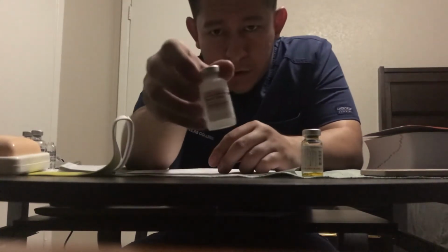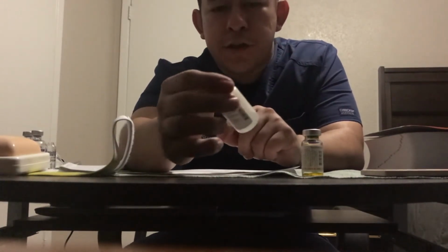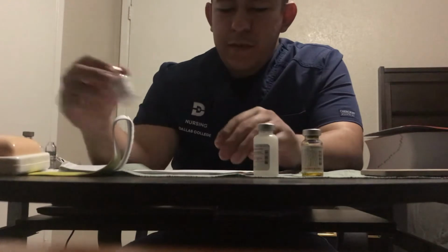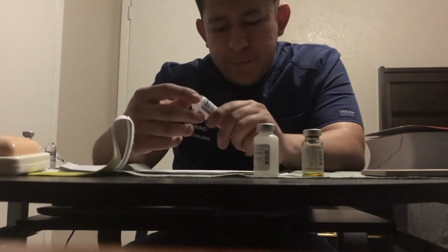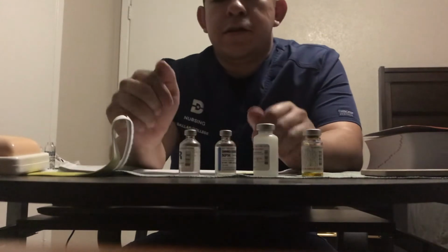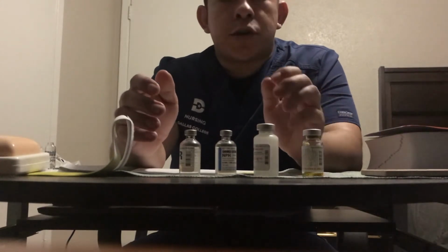And for this demonstration, I'll be using the sterile water as the tuberculin or PPD because I don't have any available, but I will also use the sterile water as sterile water. Next, we have NPH insulin for Jack Buzzard, that's right, and regular insulin for Jack Buzzard at 700. Okay, so our first check is done. We have all the right meds.